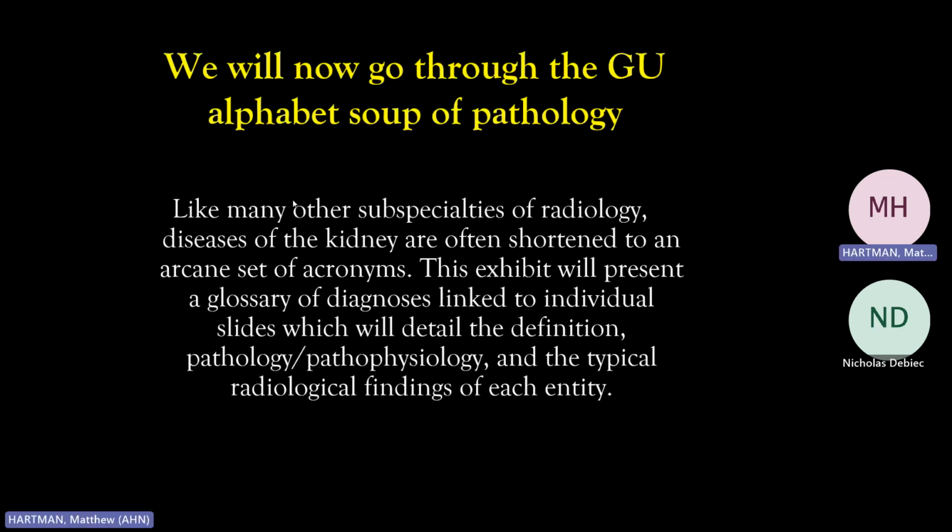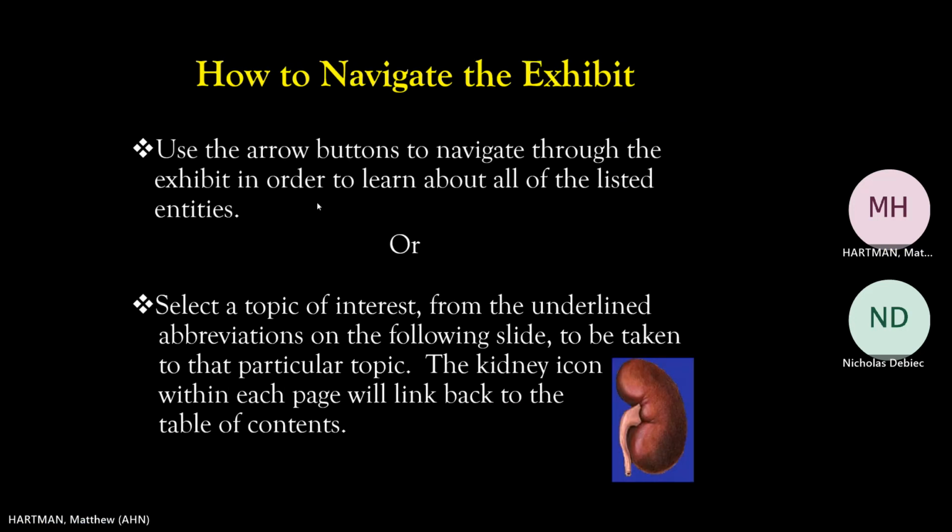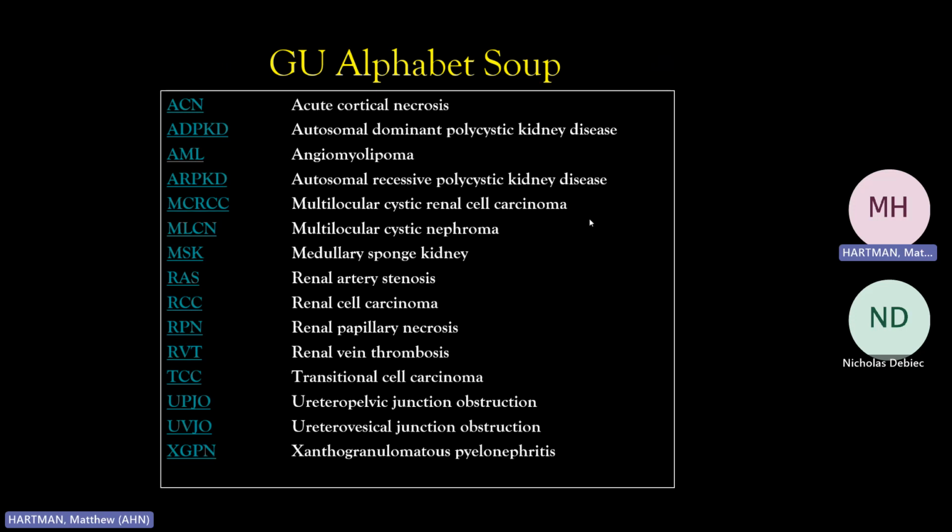So let's go through the alphabet soup of GU pathology. Again, you can go through this on your own time, go back and forth between the different pathologies. I'll be showing an overview.